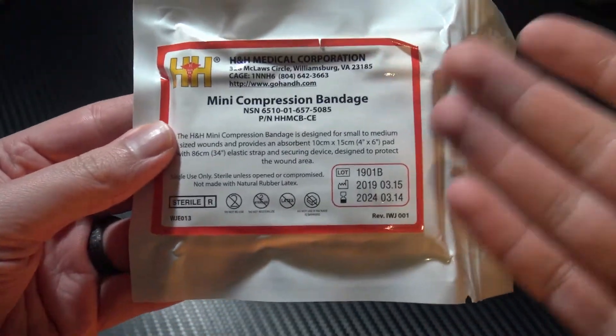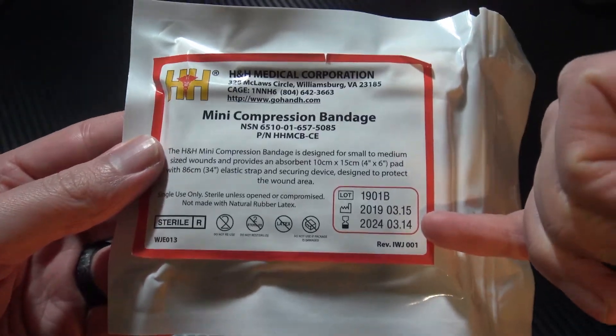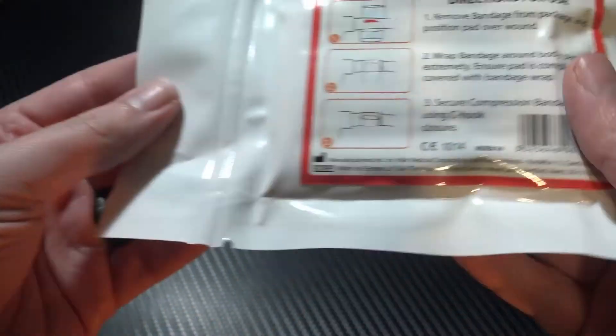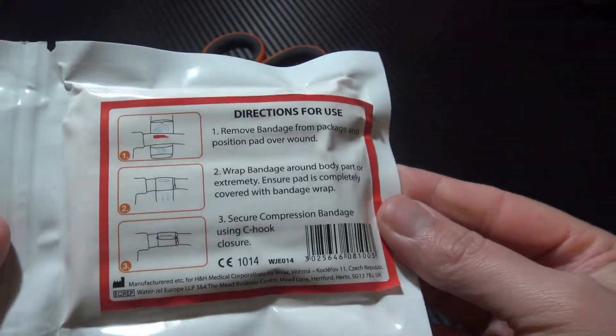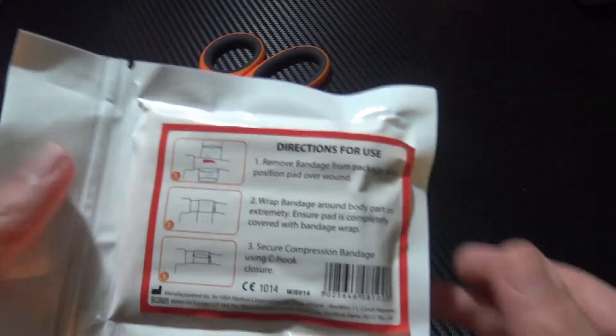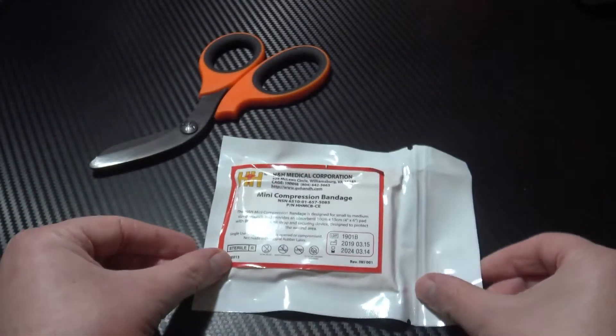On the front you have the basic information, the expiry date, manufacture date, NATO stock number and so on. On the back you have some basic instructions. So if you hand this to someone and say deal with that, they can look at this and they know what they're doing. That's pretty much the outside — we'll open it up and show you the inside.